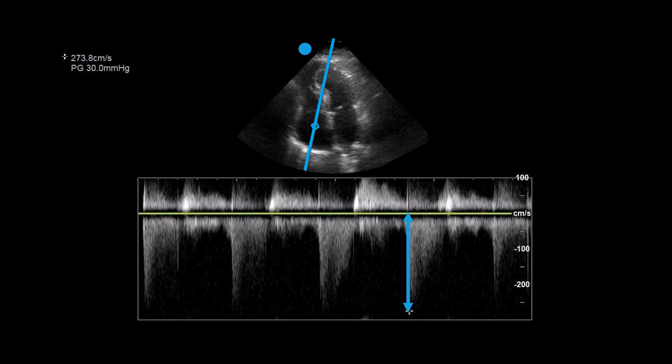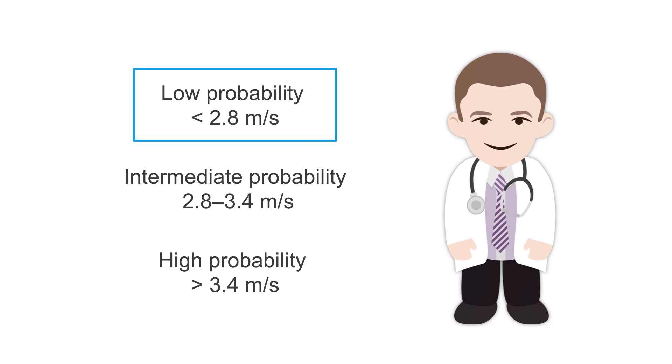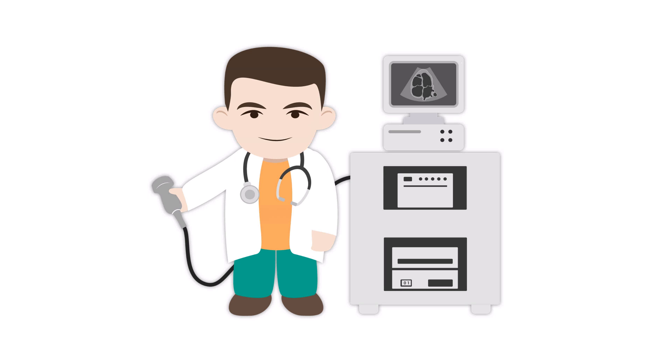Here's the continuous wave Doppler tracing of another patient. The calculated velocity of the jet here is 273.8 centimeters per second or 2.7 meters per second. This places the patient in the low probability range. Now we know two different ways to calculate pulmonary artery systolic pressure.